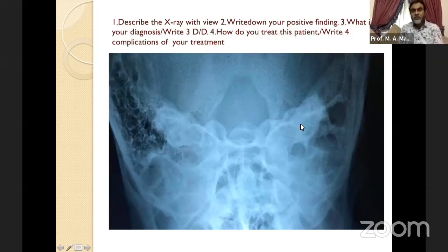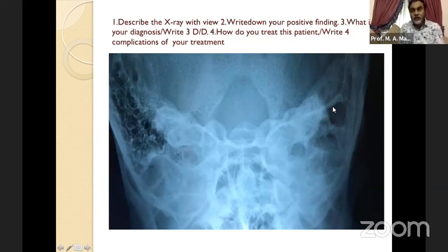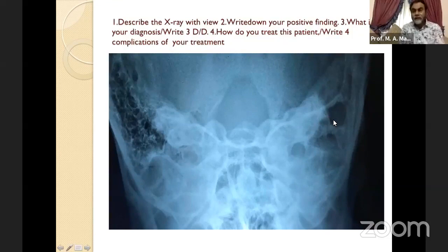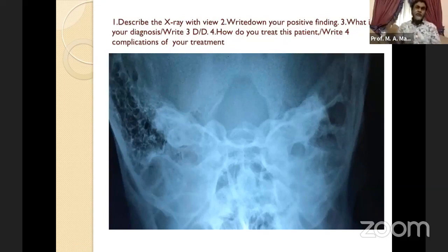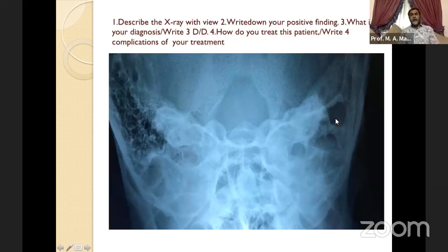What is your diagnosis? My diagnosis is cholesteatoma in the left middle ear cleft — because it can be in the mastoid antrum, mastoid air cells, and middle ear, so it is better to write 'cholesteatoma in the left middle ear cleft.' DDx: number one, carcinoma of the middle ear cleft with destruction of bones. Number two, post-mastoidectomy cavity — after mastoid surgery we drill out the bones making an air-filled cavity that can look similar.